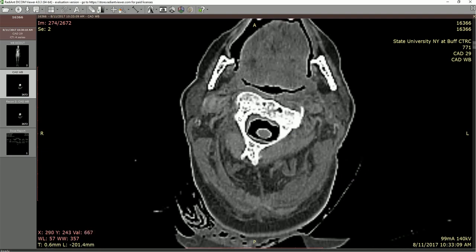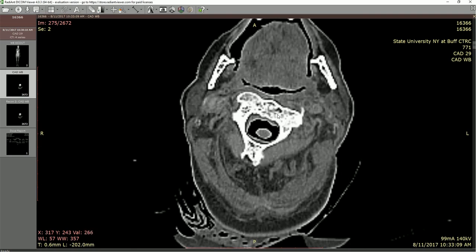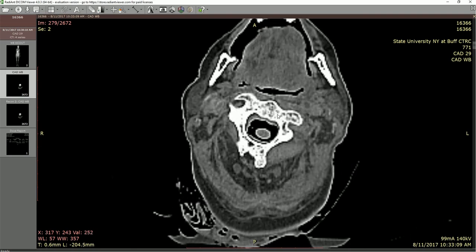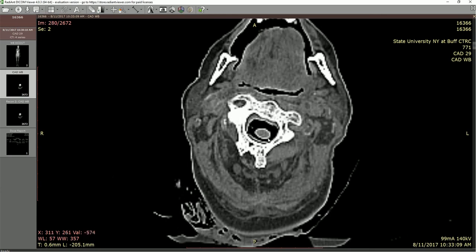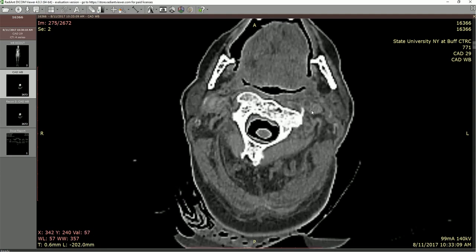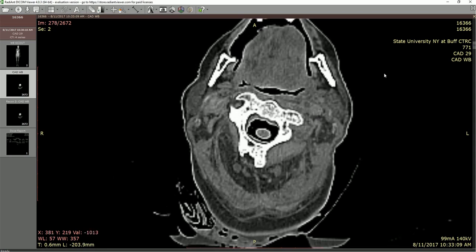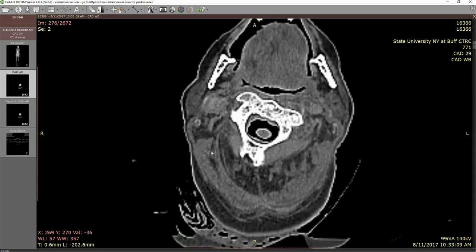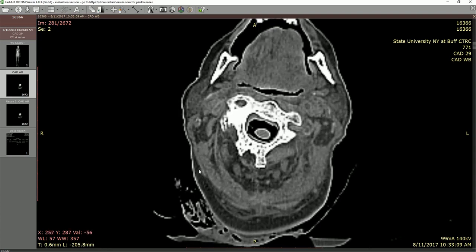A bit further takes us into C2, and we see a little bit of rotation, which relates to some pathology we'll talk about regarding the cervical vertebrae for this individual. The spinal cord is visible, and you can see the subarachnoid space shown in black because it's fluid filled, and then the epidural space on the outside, which is a bit darker due to fat. You can also start to see some of the posterior neck musculature — the splenius, semispinalis capitis, and trapezius.